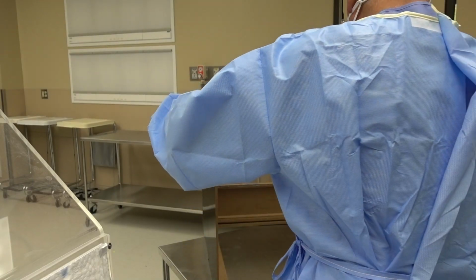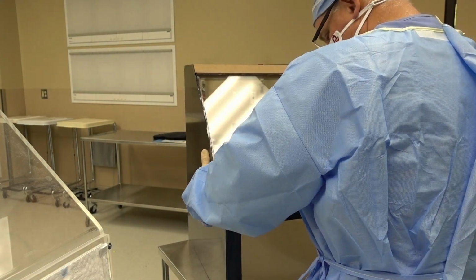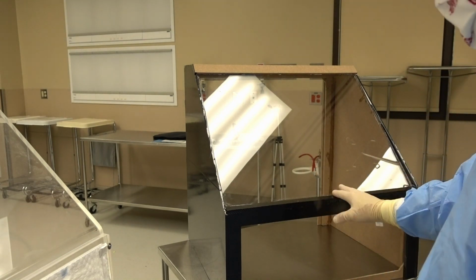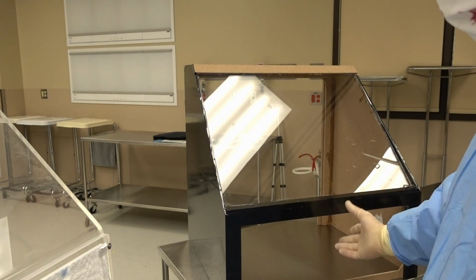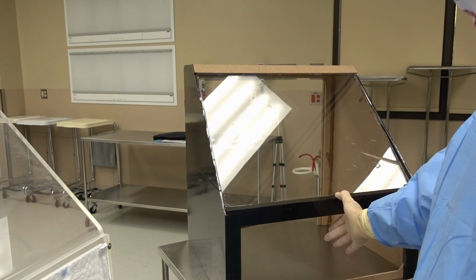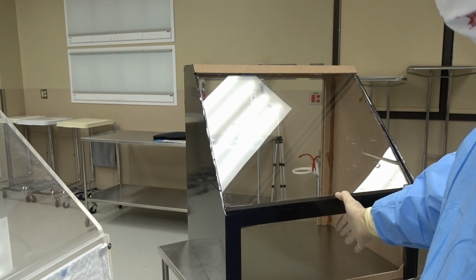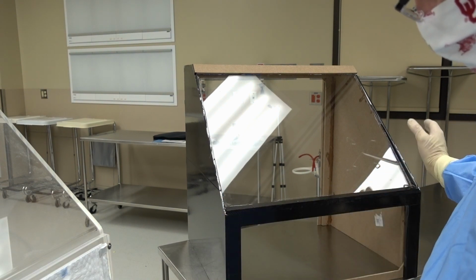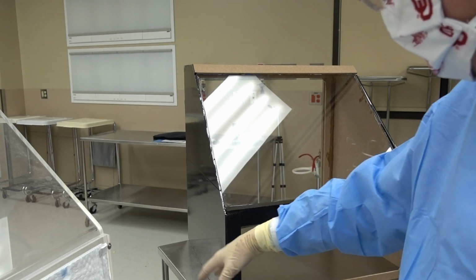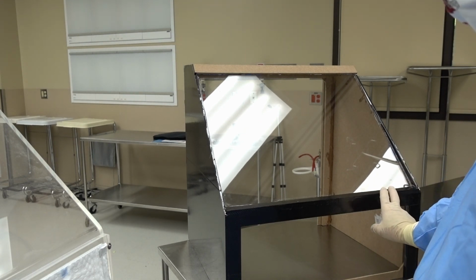We've done aerosol tests with it, with fluorescein, with a live patient being myself. I put 1 cc of fluorescein in my mouth, swished it around and coughed like crazy. Then we took a black light, we went all the way around. There was not a single drop of fluorescein on the floor, anywhere outside the containment chamber. Then we did it again.